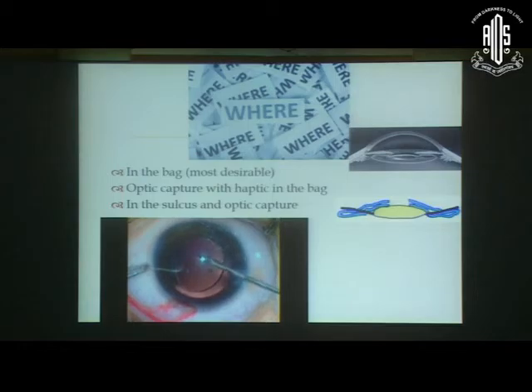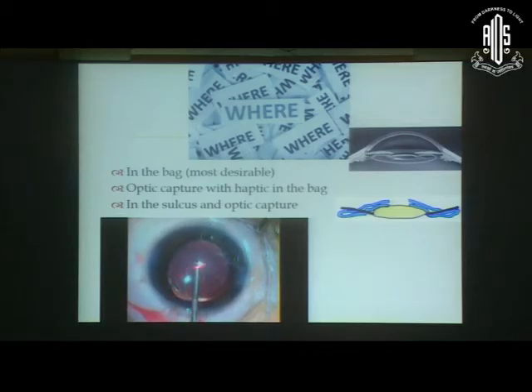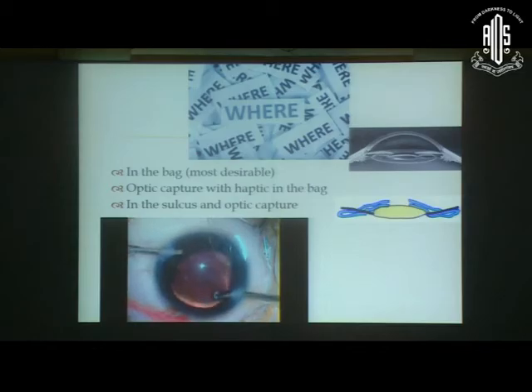I'm showing 2 videos. Here we are doing a posterior capsular rhexis with microrhexis forceps, as sir has shown. We put the IOL in the bag and then do the posterior capsular rhexis. This is how we were trained.